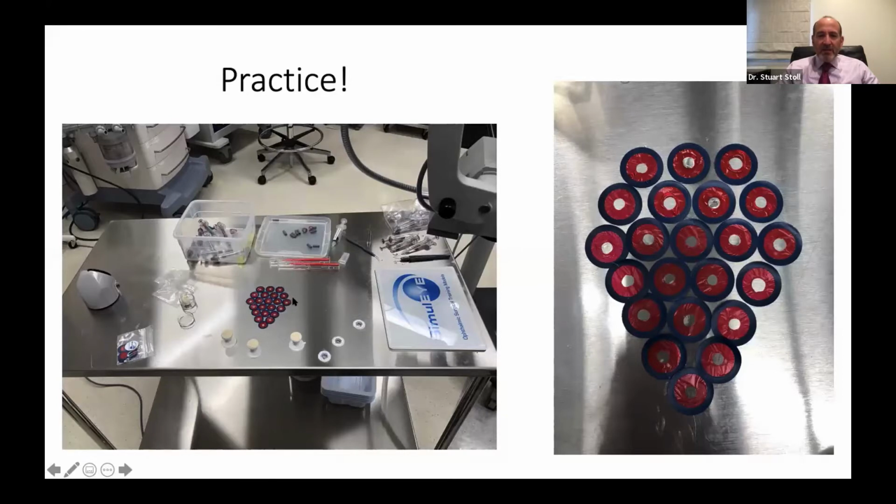They're not perfect, but they're perfect training, right? They're continuous, they're curvilinear, they're well centered, and I was using 3 different models here to keep things set up and moving along. It doesn't require a lot of setup or a lot of time. You spend an hour or 2 doing this, and you're going to gain a lot of ground. And do that a few times over the course of a month, and it's going to be amazing.